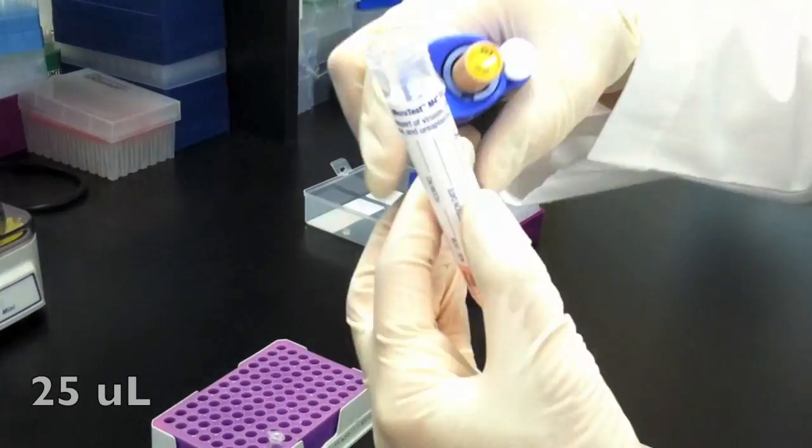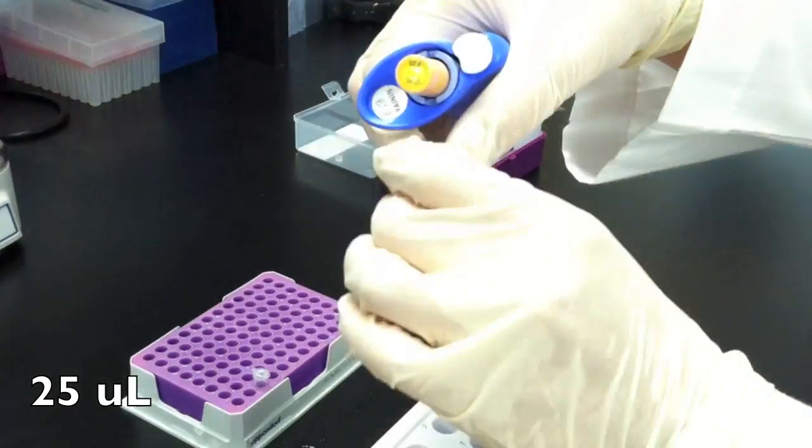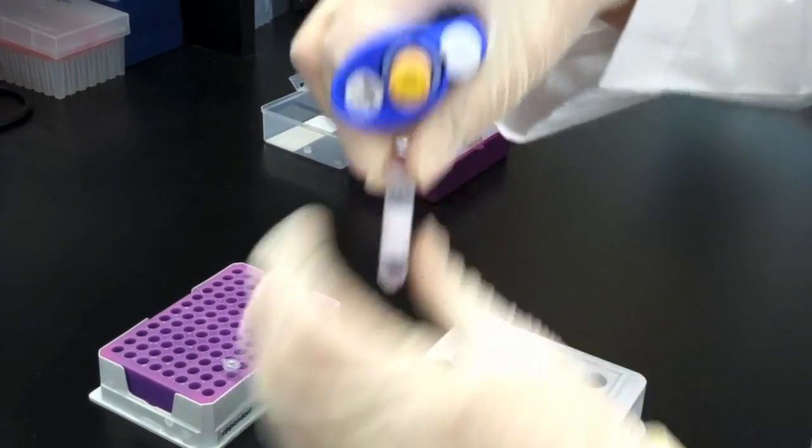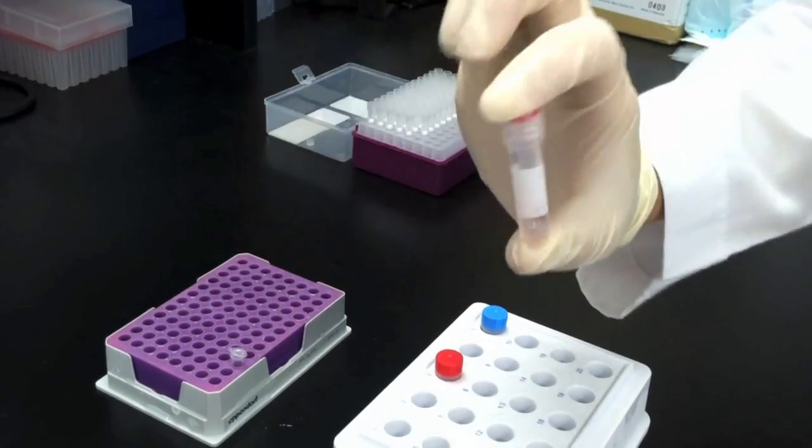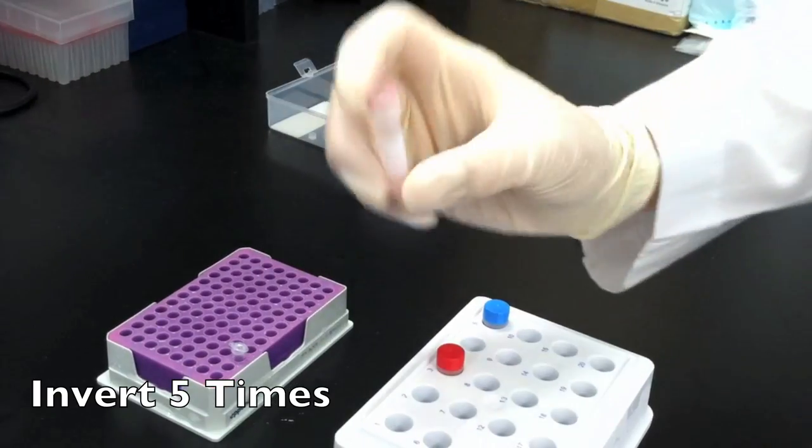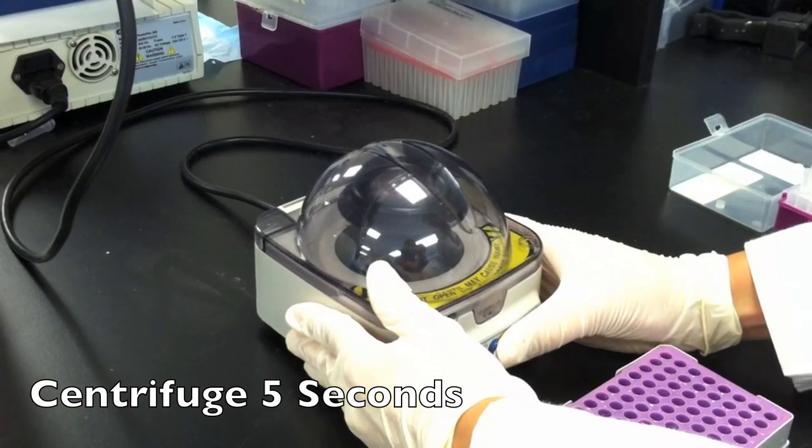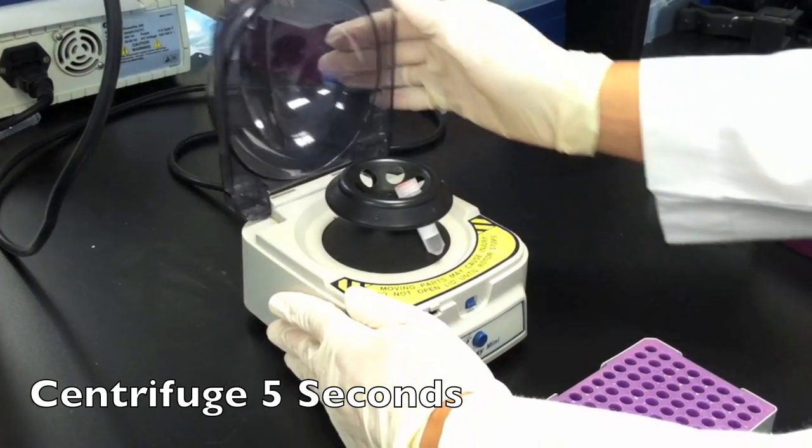Transfer 25 microliters of viral transport medium from the collection vial to a corresponding dilution tube. Mix the solution well by inverting the tube 5 times. Centrifuge the dilution tube in a mini microcentrifuge for approximately 5 seconds.